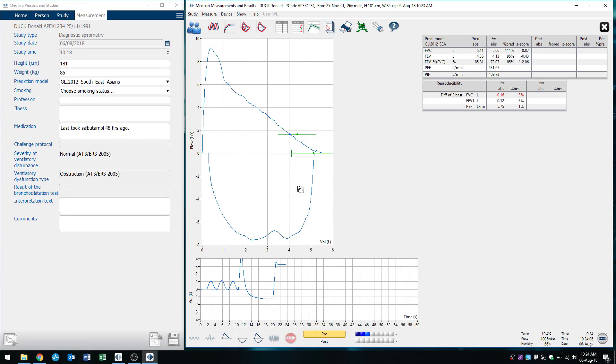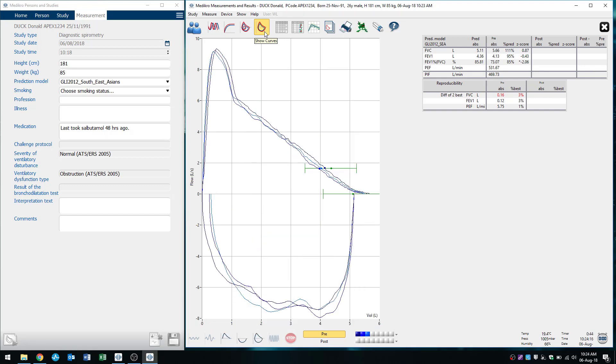So if we want to see all of our flow volume loops overlapped on top of each other, we will click this button here that says show curves at the top of each other. So all the buttons at the top are to sort of review all of our results. And that's what we want to click on after we perform the testing, whereas the buttons at the bottom here are the buttons we need to press when we want to perform testing.